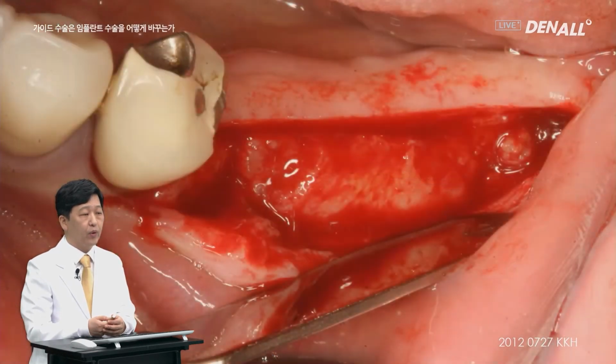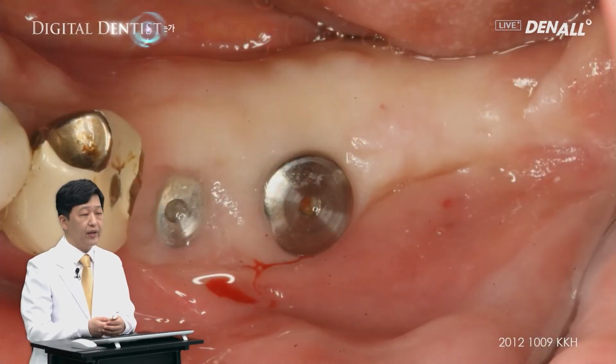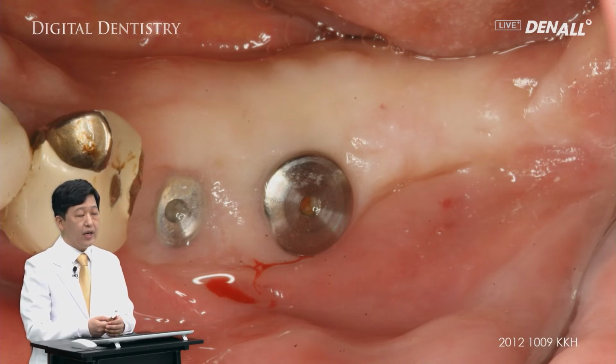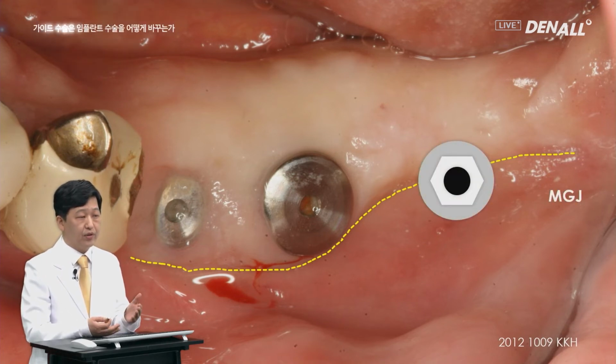This is a different case. The traditional way was used to reflect a flap and three implants were placed. In the case of number 37, primary stability was not good and it was submerged. After 3 months, a second surgery was done. As shown, number 35 and 36 are within the scope of keratinized tissue. However, number 37 is completely beyond the mucogingival junction. And this was anticipated ahead.